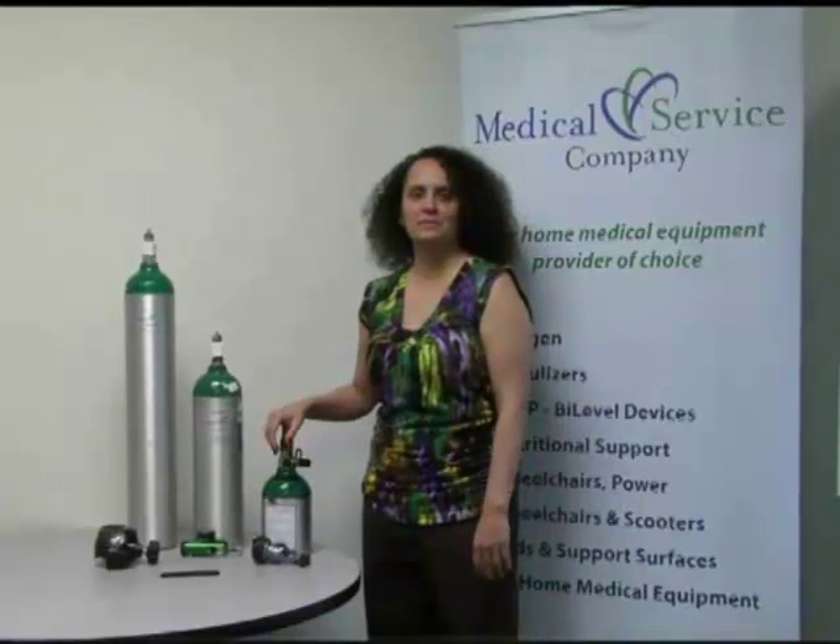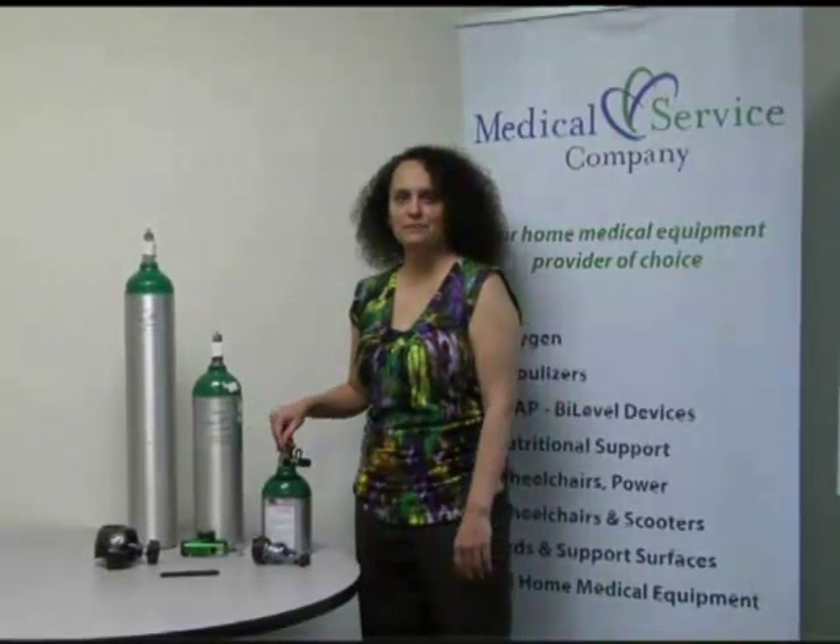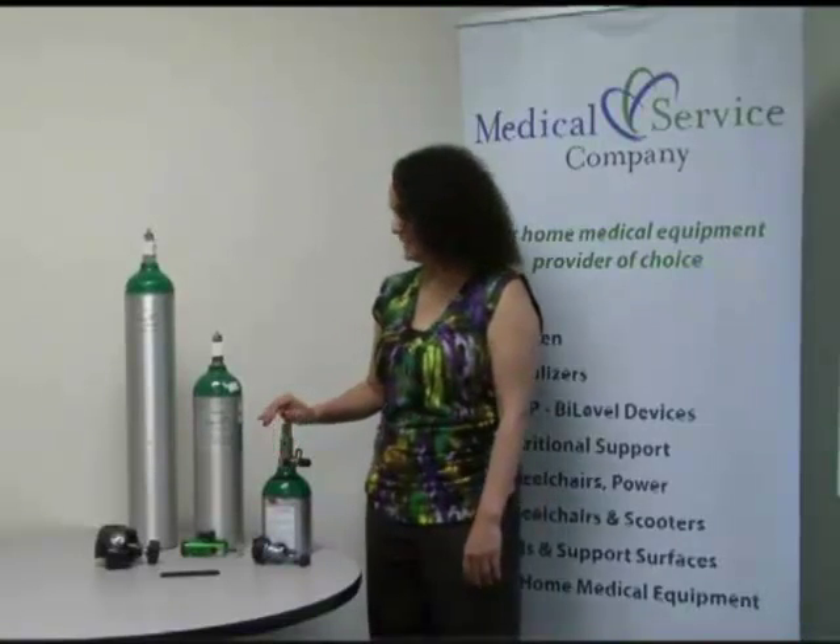I'm Billy Jo with Medical Service Company. I'm a respiratory therapist and today I'm here to show you a couple of different oxygen tanks and how to connect the gauges to them.